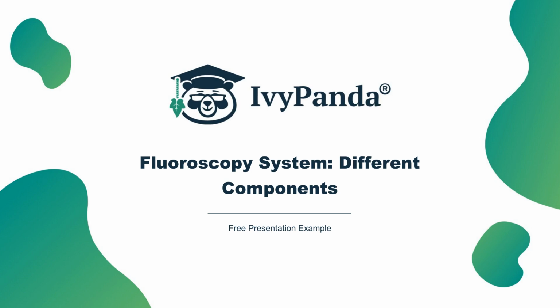Components of the cesium iodide amorphous silicon indirect capture detector. The main components of the cesium iodide amorphous silicon indirect capture detector are the scintillator, the photodetector, and a TFT array, which consists of a readout, charge collector, and light-sensitive elements. The panel is arranged into detector elements and is covered by the scintillator plate.